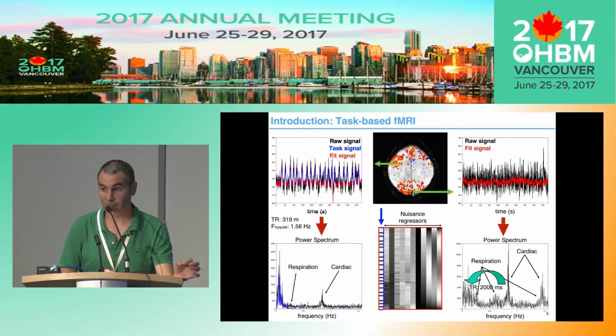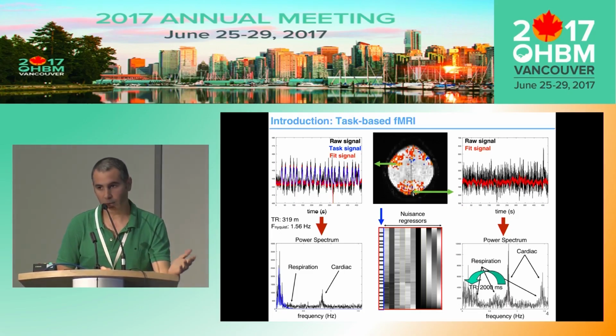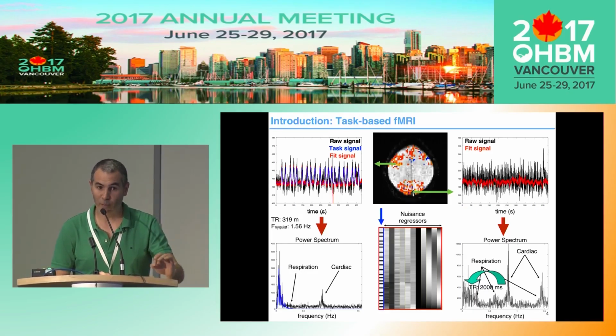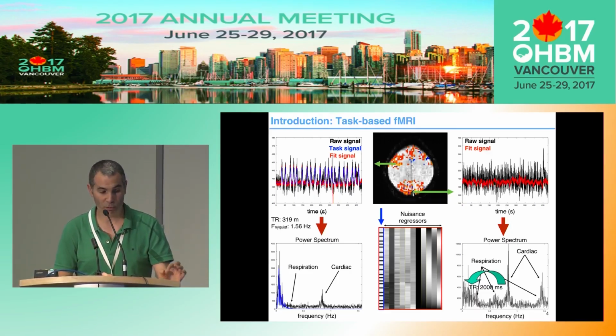The problem is that most of the time our TR up to now, because we now have multi-band sequences that allow us to accelerate the acquisition, was about 2 seconds. So all these components are aliased and moved to the low frequency range where the BOLD response occurs, so we cannot actually distinguish them.